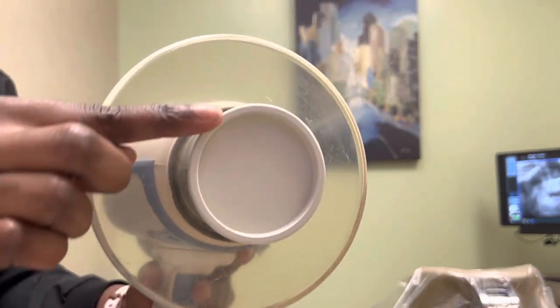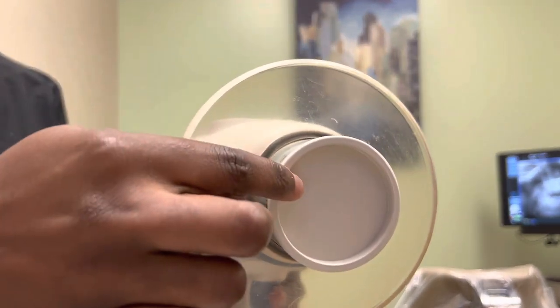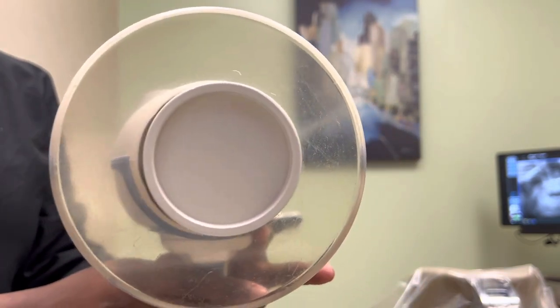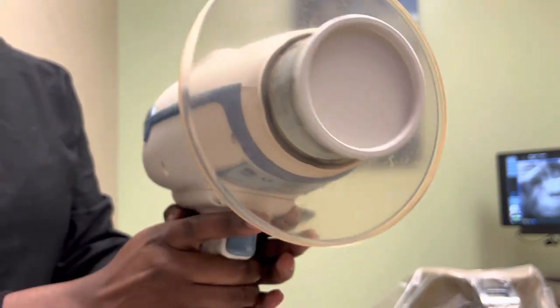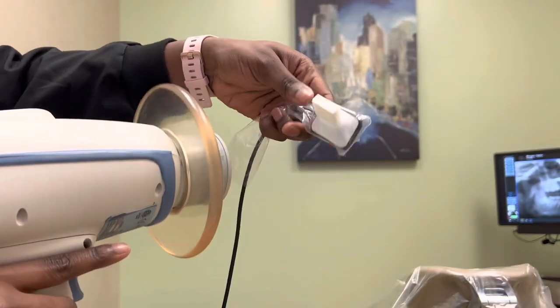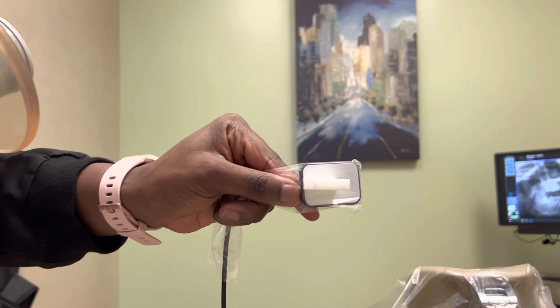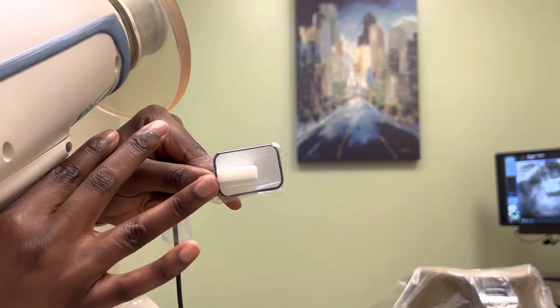The goal for the perfect x-ray is to make sure the edge of the cone circle is covering the edge of the spongy tab as it points out of the patient's mouth. Typically when I'm taking the x-ray, I have the patient smile big with their teeth showing so that I can see the edge of the white tab.